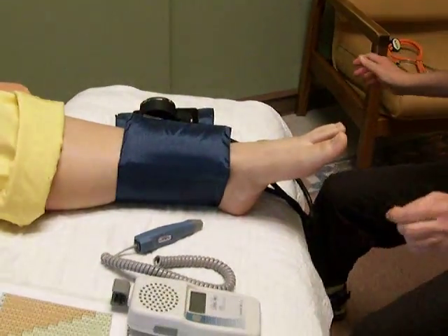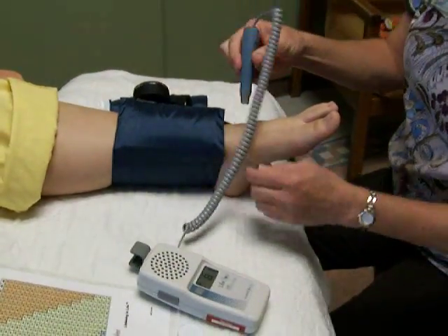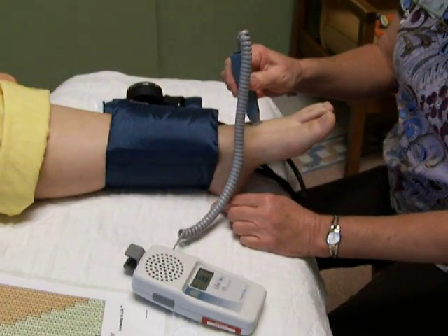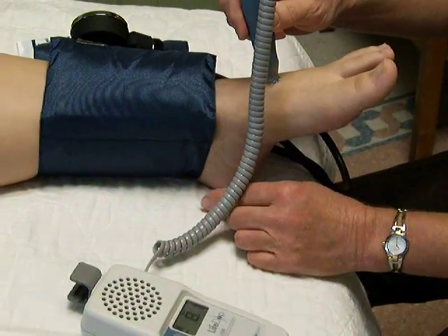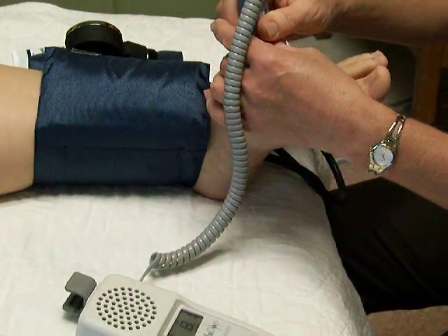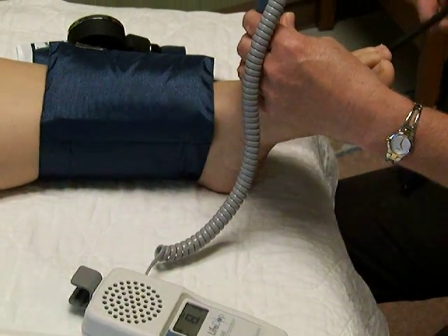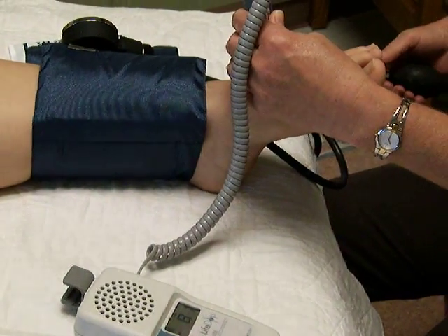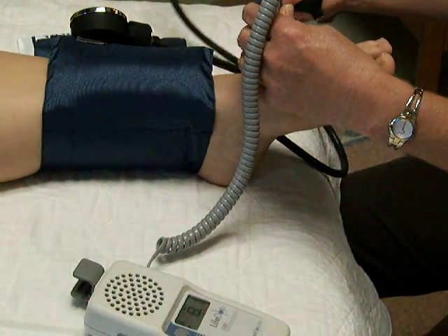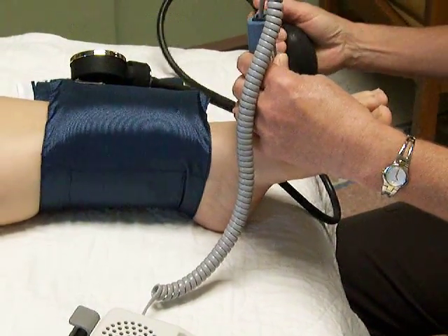Prior to inflating the cuff, you want to use your Doppler and locate the dorsalis pedis pulse. Then you inflate the blood pressure cuff to the point where you obliterate the sound.